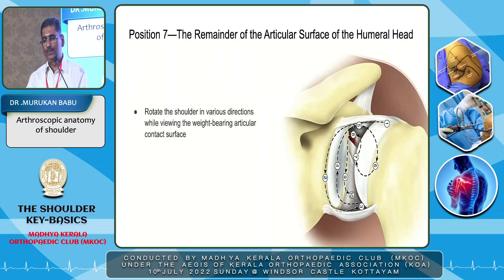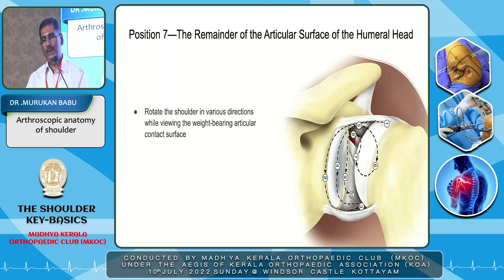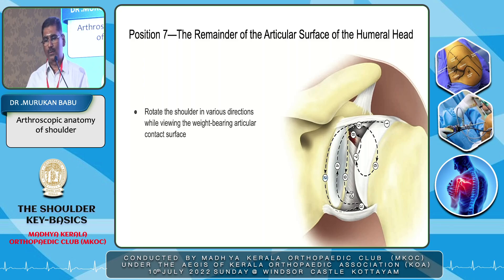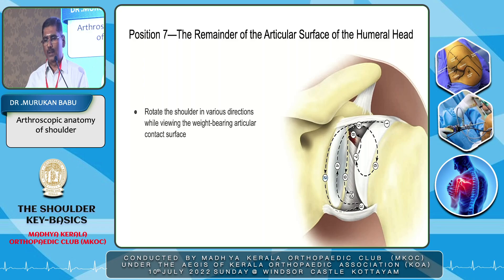Coming to the seventh position — the remaining part of the articular cartilage, that glistening articular cartilage. There are no major anatomical variations described in the humeral head as in the case of the glenoid. The only things you should look for are any pathological fraying or cartilage loss — but those are pathological findings that will be covered in diagnostic arthroscopy by the other speakers. In the seventh position, you see the articular cartilage of the humeral head.